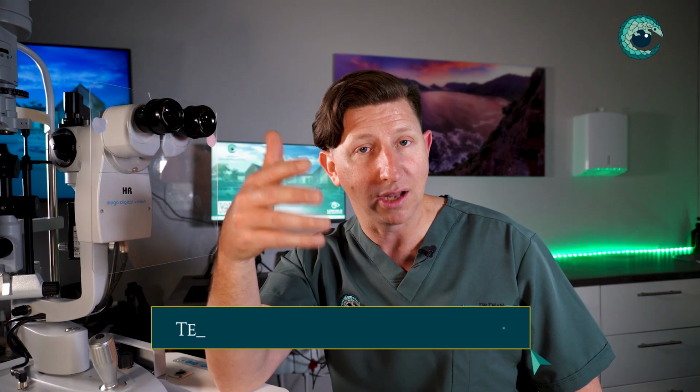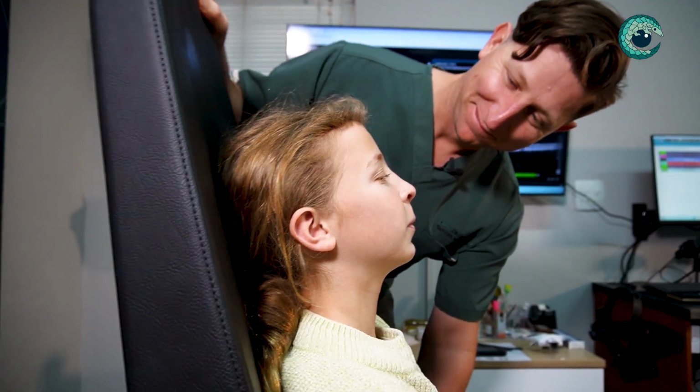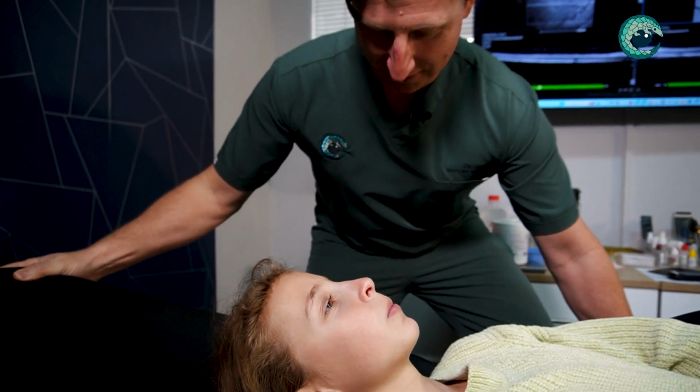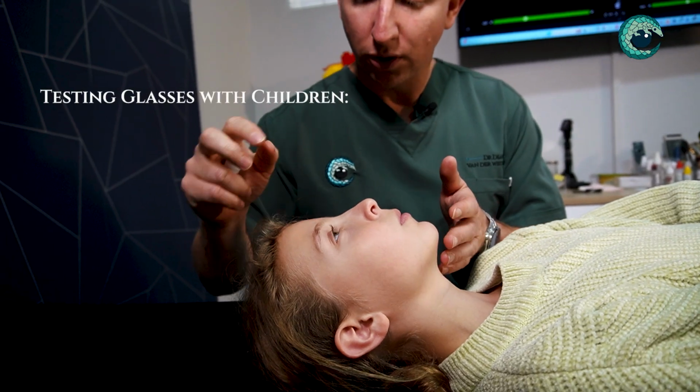So how do we do this? How do you test glasses in children? Obviously there are a lot of contexts where it's essential to get the correct glasses for children, especially if they have a squint, if they have amblyopia, or one eye is a lazy eye, etc. It's really important to get this right. The way we do it is with cycloplegia.